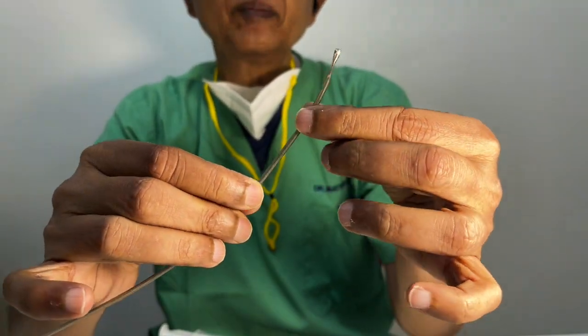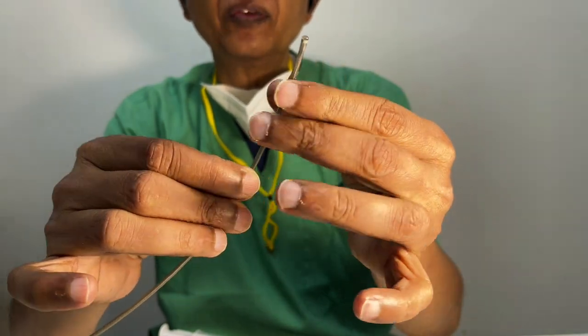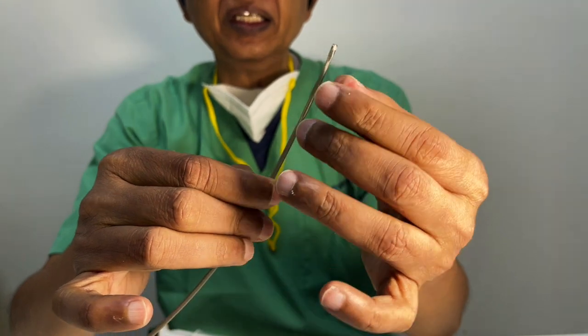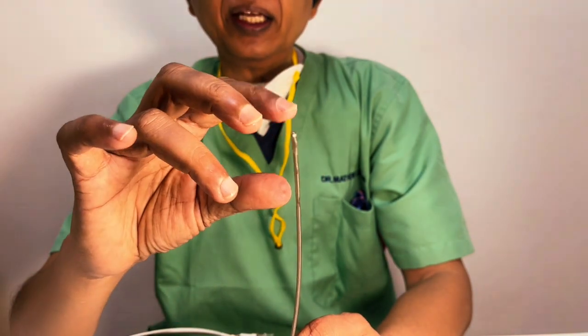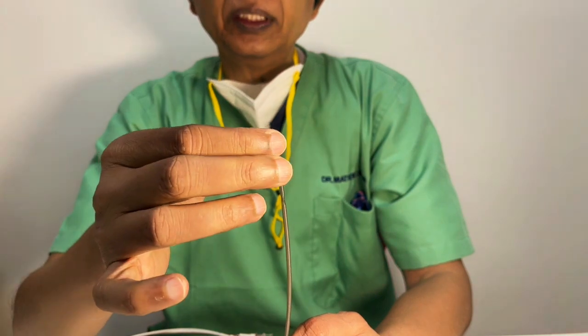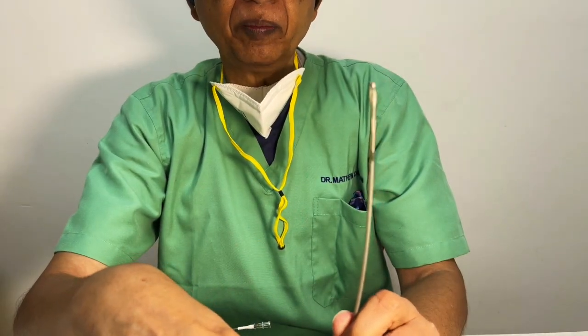But remember, these catheters also kink because they use stainless steel. And the reason they use stainless steel for this is because of the much better rigidity for taking a device. But technically, these are in real life a little more trackable, I think, across a bend compared to the Neuromax, but otherwise there is not much of a difference.